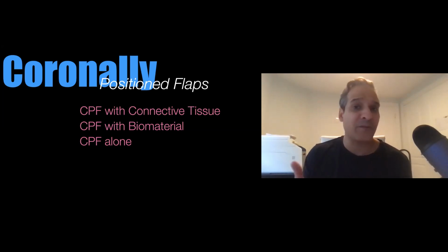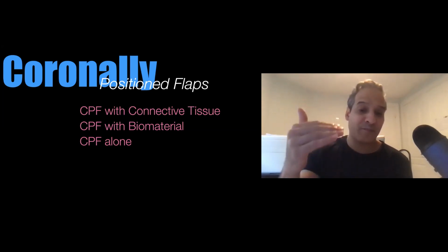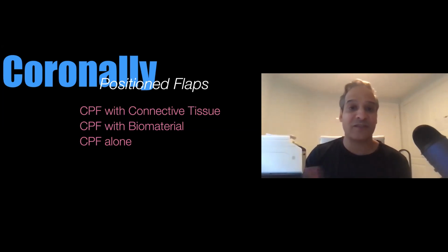One is a coronally positioned flap where we make sulcular incisions and position the flap coronally with a tissue graft. The other is a lateral sliding flap, where rather than positioning something too far apically, we just slide it over. And then the last one mainly is tunneling.